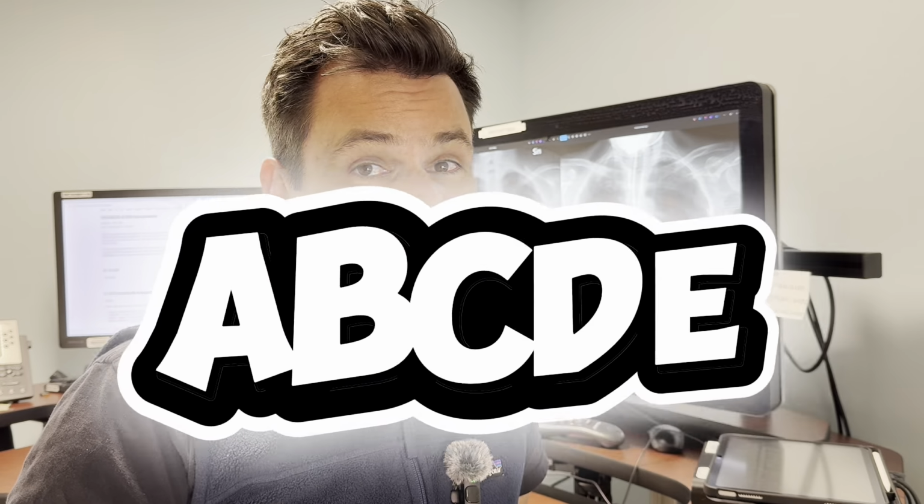You want to stop reading chest x-rays like a medical student and start reading them like a radiologist? If so, you're going to want to get rid of your ABCDEs. I'm Dr. Jesse Smith. I'm a third-year radiology resident, and I'm going to give you a framework to read your chest x-rays like a pro.